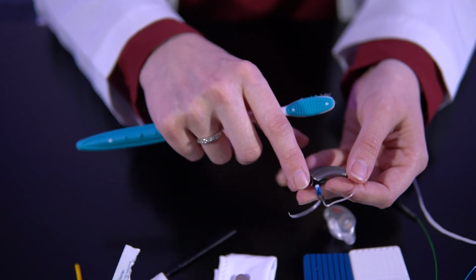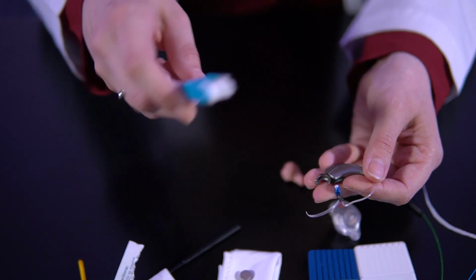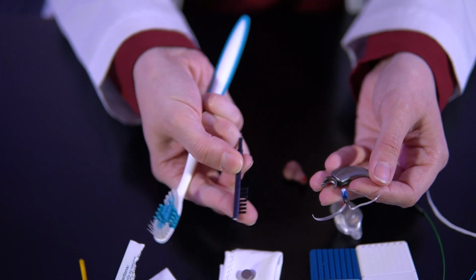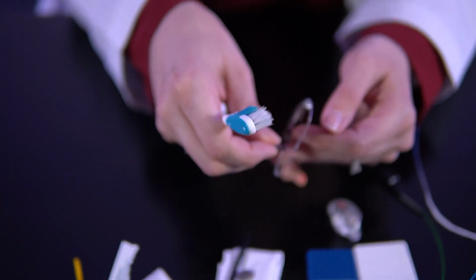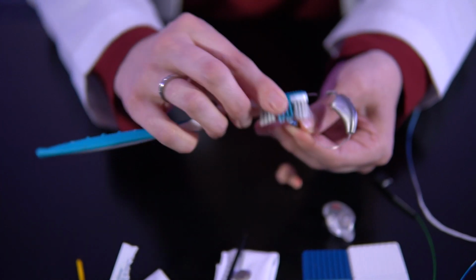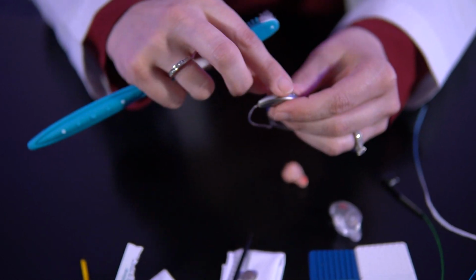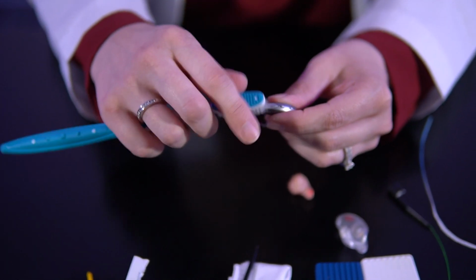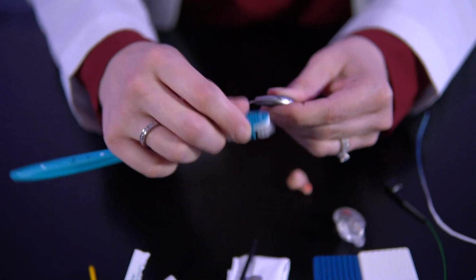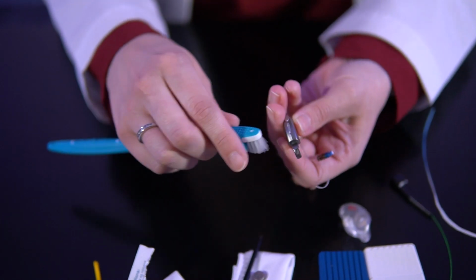All right, after changing my wax filter, like I said, I like to use a good toothbrush. An old toothbrush is perfectly fine, or you can use this one that you got in your cleaning set as well. And I'm just gonna brush everything off. So I'm brushing off my filters area with my receiver. My microphones are up here, so I wanna brush around that area, because if your microphones get dirty, it'll make it very difficult to hear.